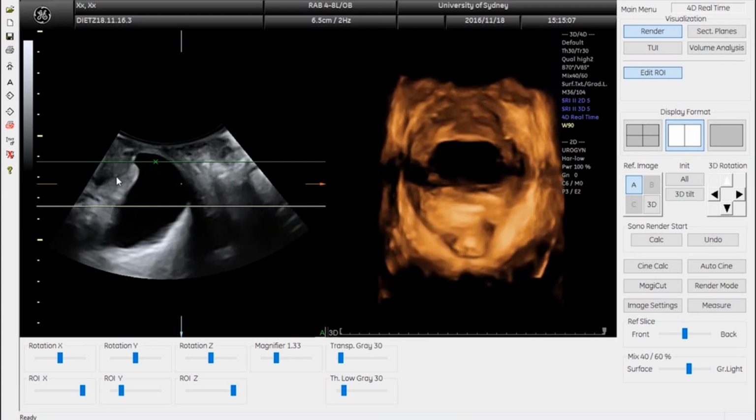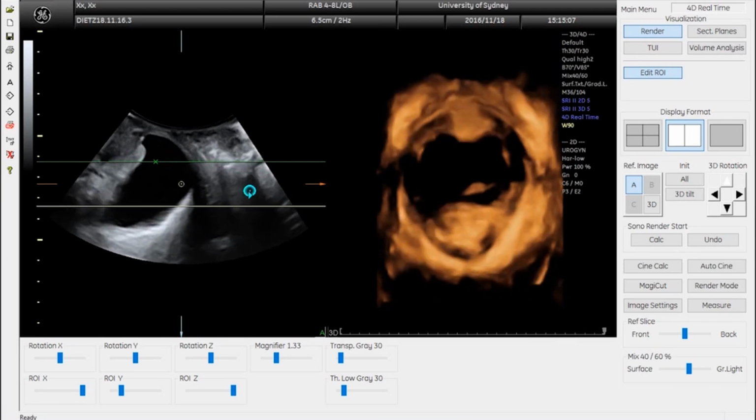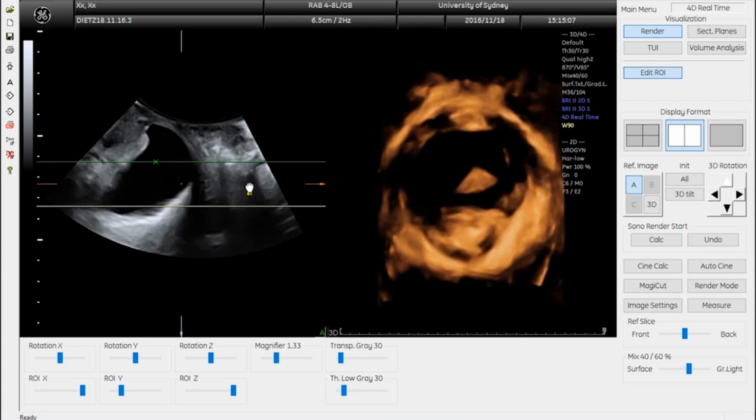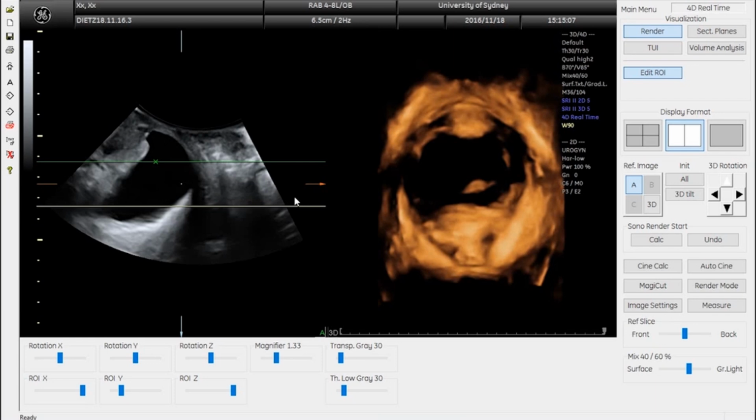There's marked urethral kinking like so. There's the bladder neck, which comes down to at least 2 centimeters below the symphysis pubis. There's the cervix in this area here, and there's the rectum with a small rectocele here. And what we really want to do right now is to measure the hiatus, the largest potential hernial portal in the human body. You can see that the contour here is rather distinct.